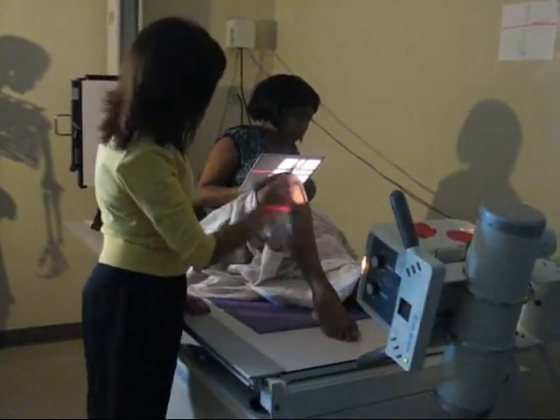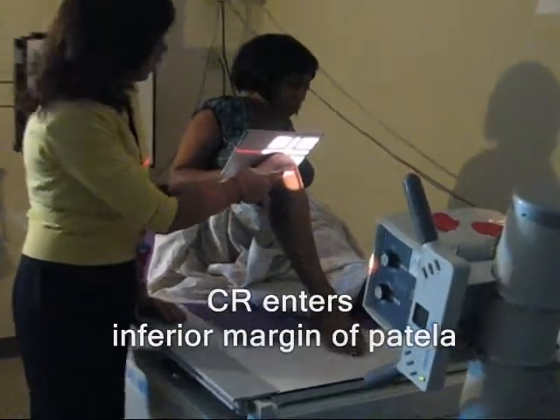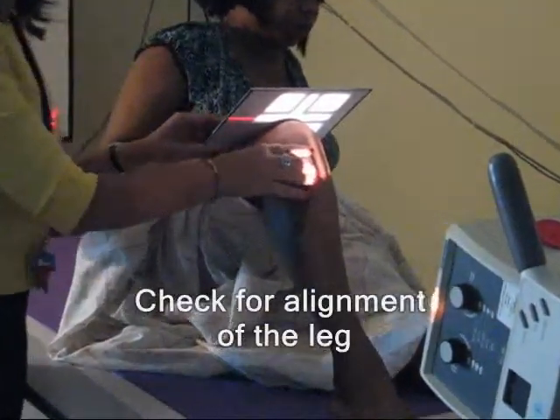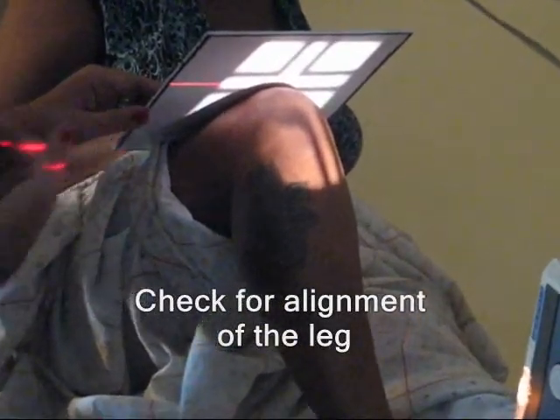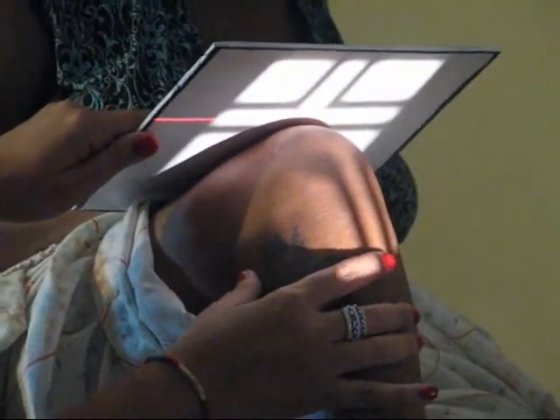You want the CR at the inferior margin of the patella. Patients will have the tendency to let their knee drop to the outside laterally, so make sure you have them keep still.